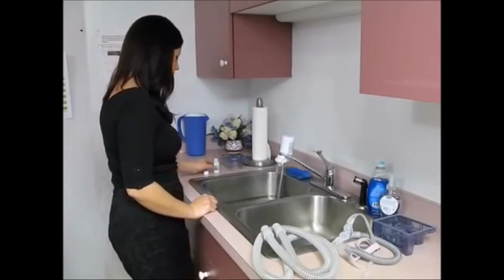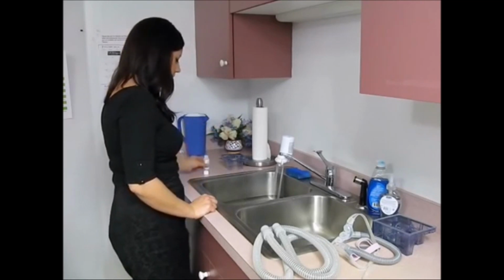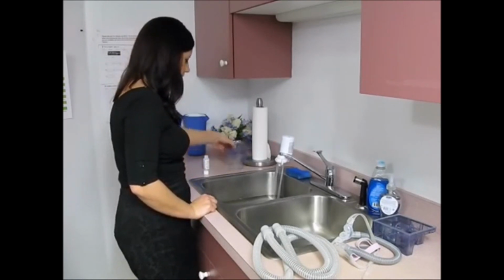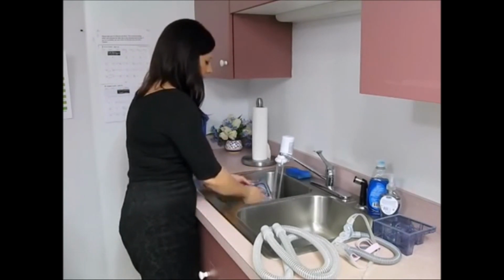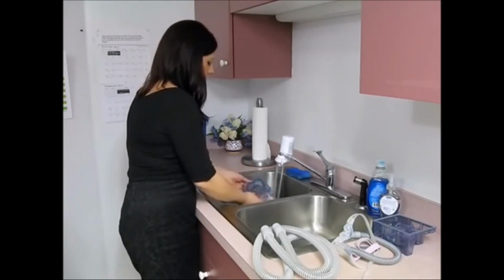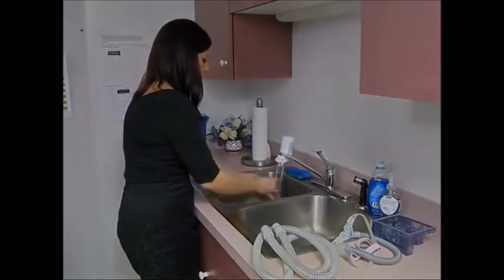Add about 1/4 of the supplied pre-wash to a gallon of water. Wash your mask, hose, and humidifier reservoir and rinse thoroughly with water. Besides doing this before using your SoClean for the first time, you can use the pre-wash whenever you hand wash your equipment or when you introduce new equipment into your rotation.